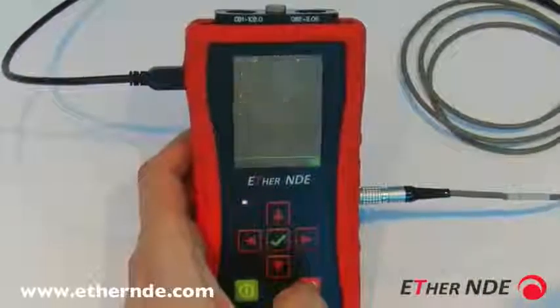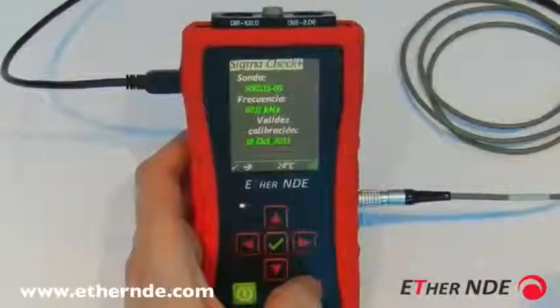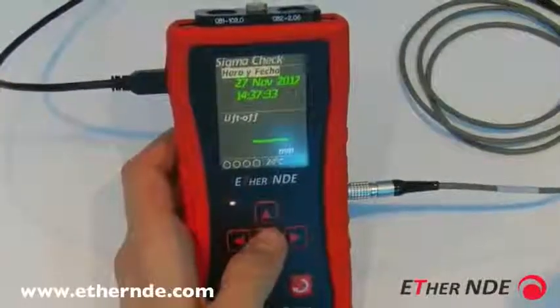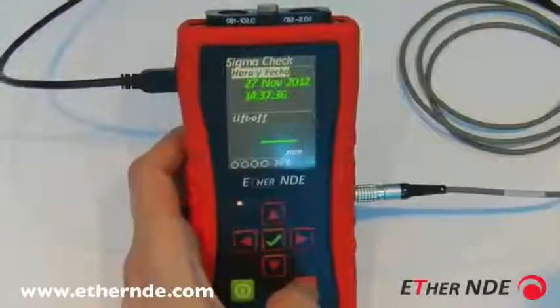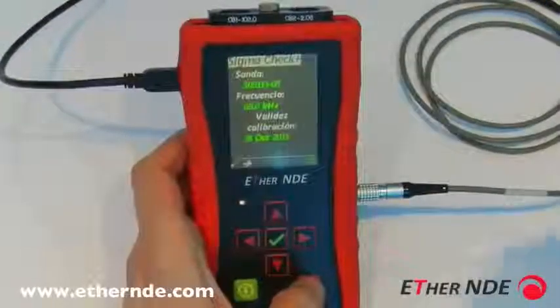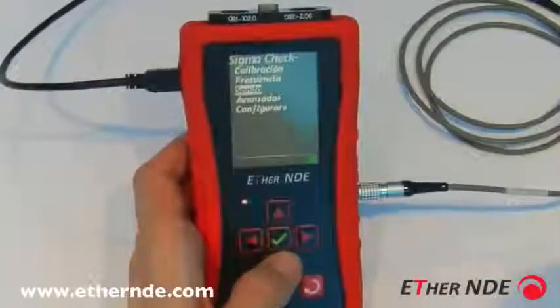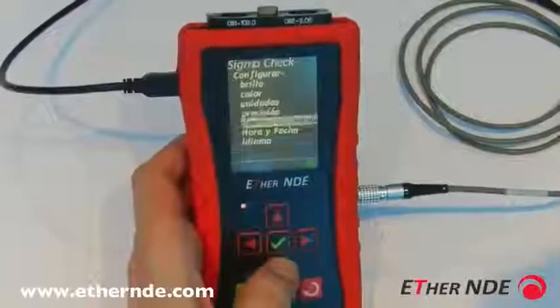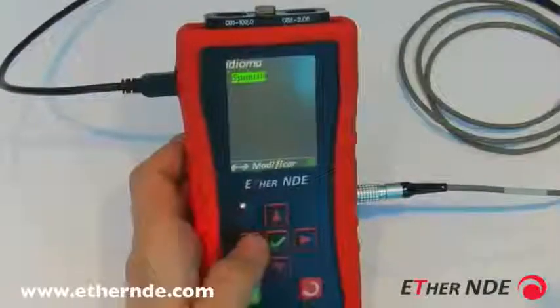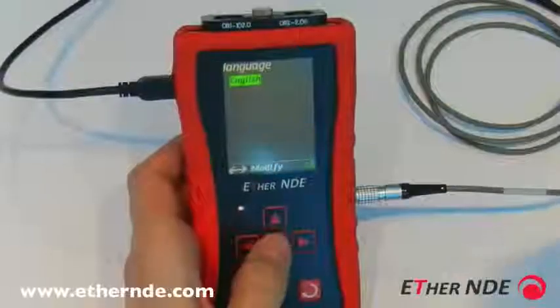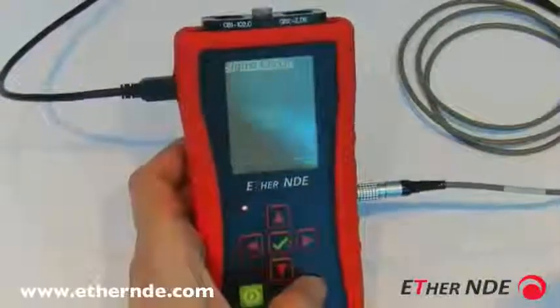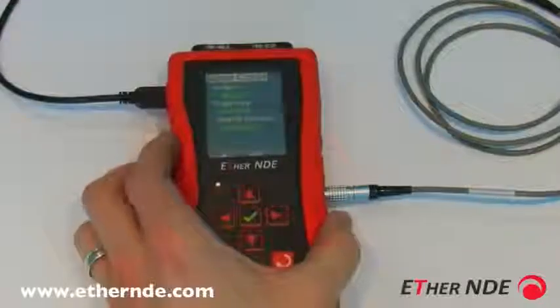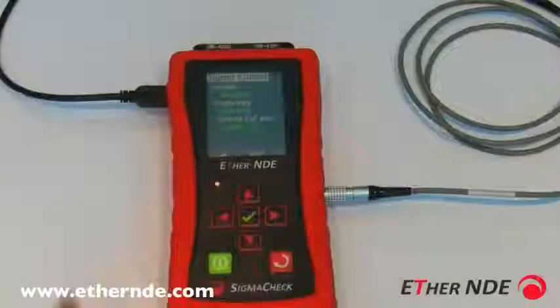You can see all the menu items now appear in Spanish, and all text in the Sigma Check is now in Spanish. We'll now repeat that procedure to simply set the language back to English. That covers configuring the basic operation of the Sigma Check.